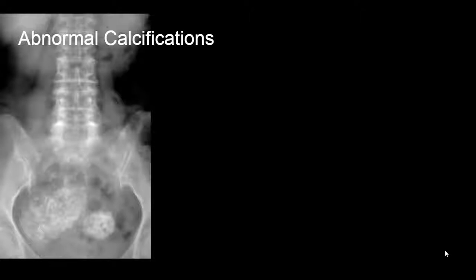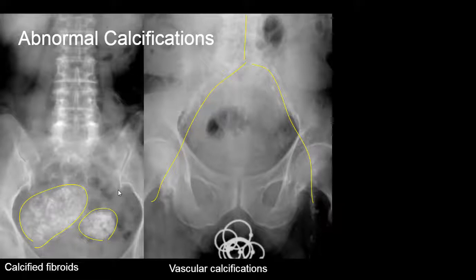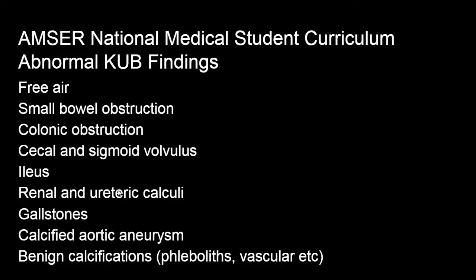Here are some more examples of abnormal calcifications. On this radiograph we see coarse dystrophic calcifications in the pelvis, which are seen with calcified fibroids. We also see abnormal linear calcifications that are vascular — these represent severe vascular calcifications. Finally, calcifications here correspond to calcified gallstones. This is a summary of some of the important findings we can see on abdominal radiograph.